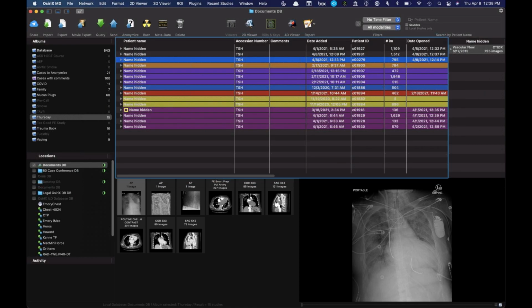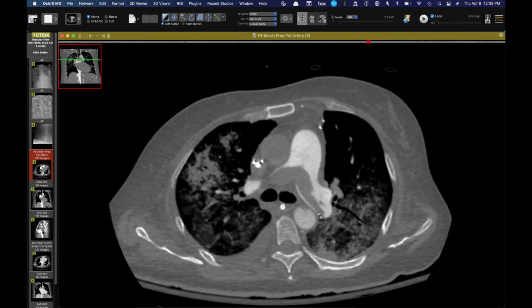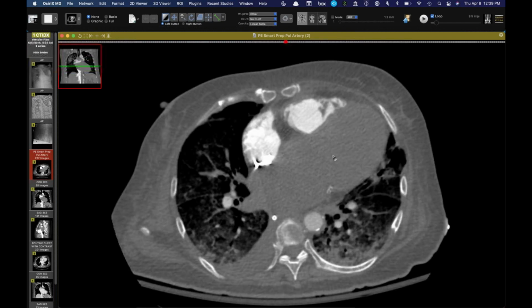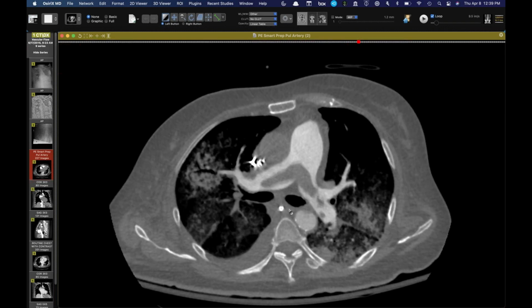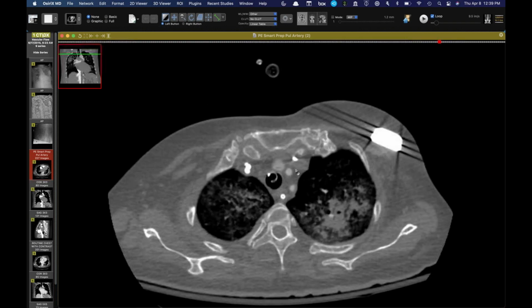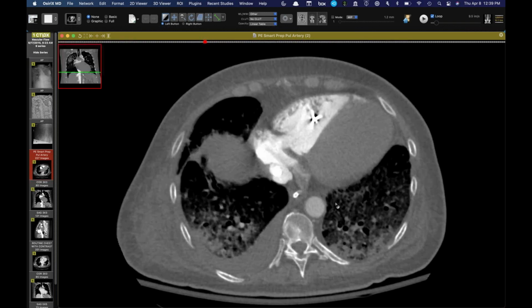I don't think I ever showed this, but this was a few years ago. This was another one. And that article specifically talks about the competition in the left ventricle with forward pumping in a case like this, where you have something like pulmonary embolism, where the right ventricle may be failing, but the left ventricle may still be pumping. Now, in this patient, they were also on veno-arterial ECMO, and they have still the same thing, but you can imagine how the watershed area could be in the arch, or could be even a little bit more distal based on the amount of flow that's coming forward from the left ventricle.